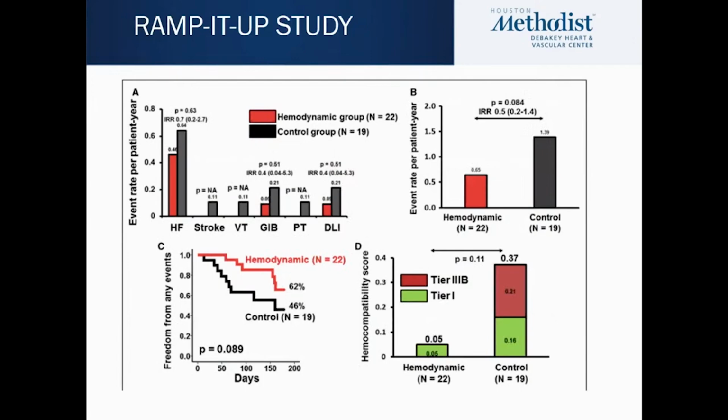So why do we need imaging in these patients? A lot of times when we consider imaging, we're asked why we want a follow-up echo on LVAD. It is important to understand that if you're not hemodynamically well supported by the LVAD, there is a higher likelihood of bad outcomes.